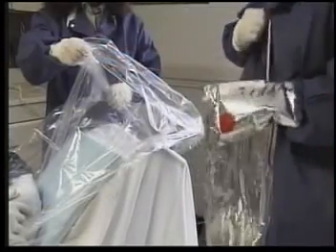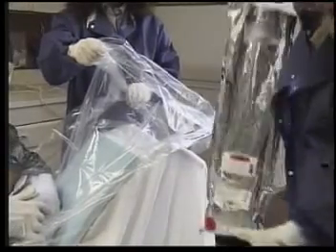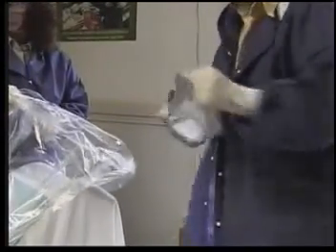When everything is ready, remove the lock between the iso and polyol. Mixing the iso into the polyol starts the foaming process. Vigorously mix for about 15 seconds. Should you need to abort the process at this point, drop the bag in a trash container.